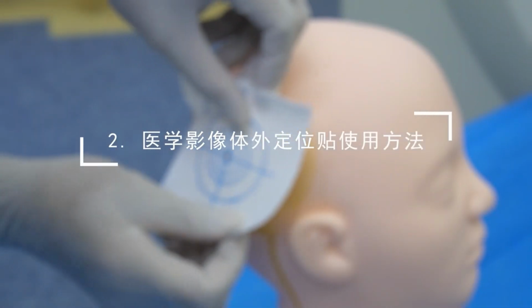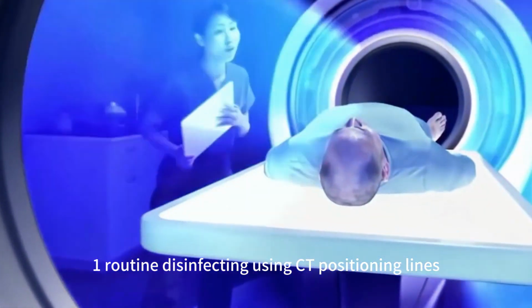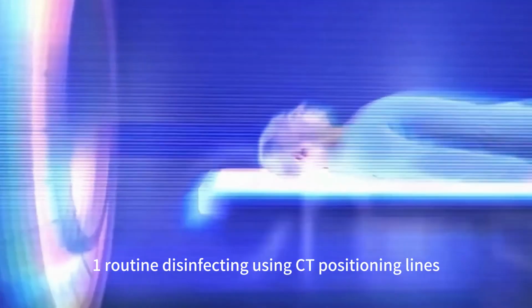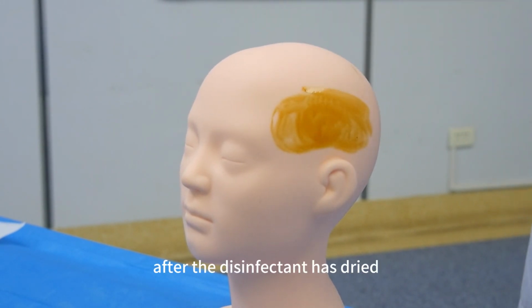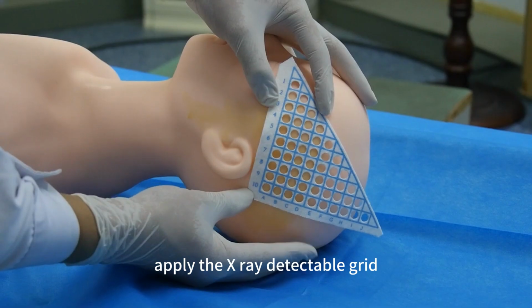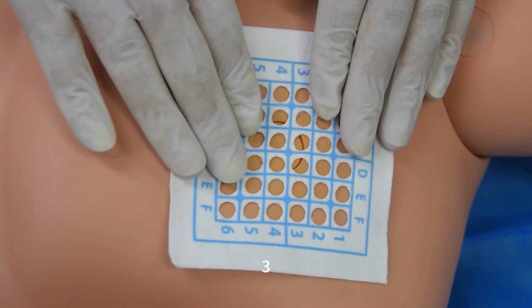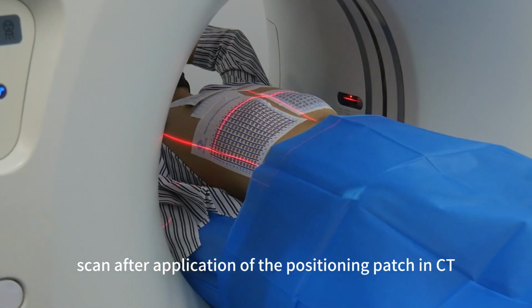2. Usage of the X-ray detectable grid. 1. Routine disinfecting using CT positioning lines. 2. After the disinfectant has dried, apply the X-ray detectable grid. 3. Scan after application of the positioning patch in CT.